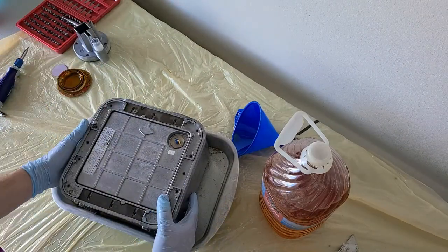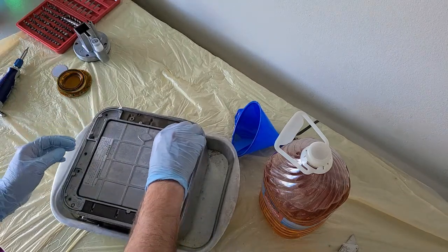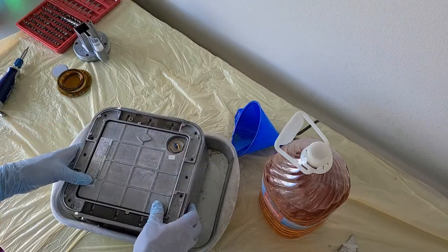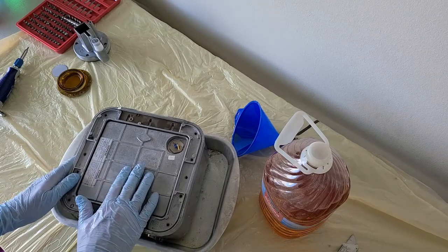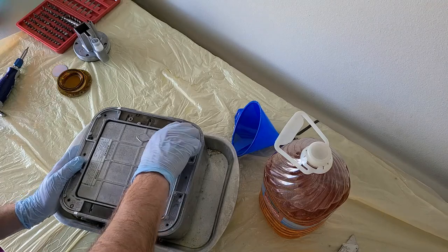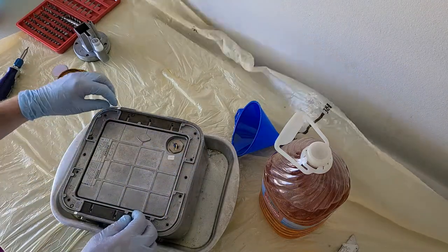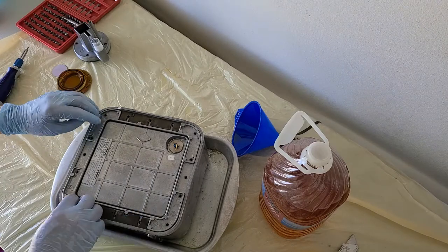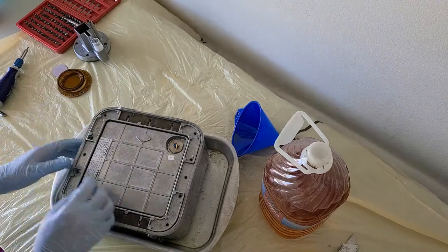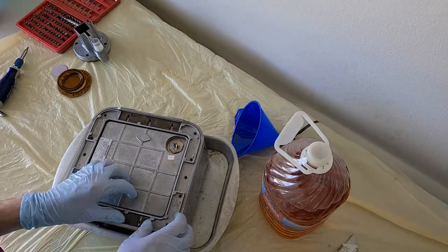All right, so we have the plate loose. Let's go ahead and see if we can... I see the inside here is free. It's moving around. We've got to figure out this outer part now. Make sure it'll pry right off. Let me go get a little flat tip screwdriver.